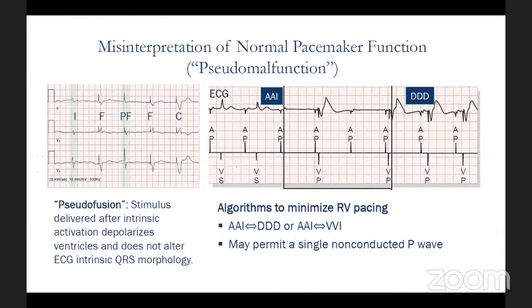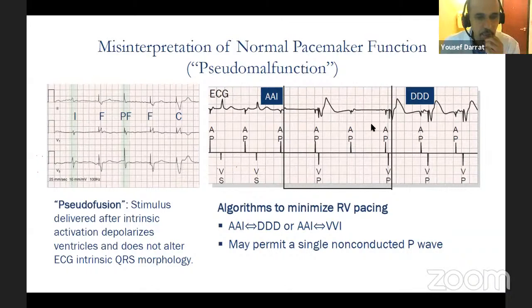Very nice. I can add an example. Last week, I saw a patient with physiological noncapture, and she had the MVP mode on, which caused some pacing spikes. Once we turned the MVP mode off and prolonged the AV delays, it fixed the issue. I can show you the EKG. Actually, let me show you the EKG.